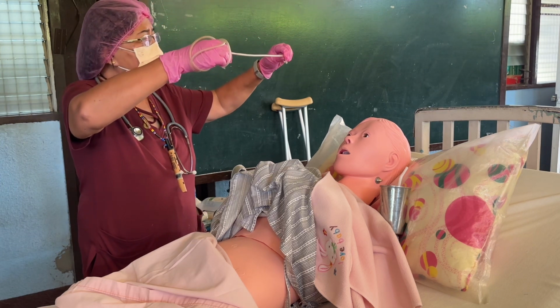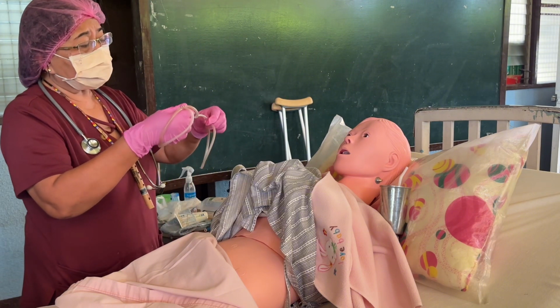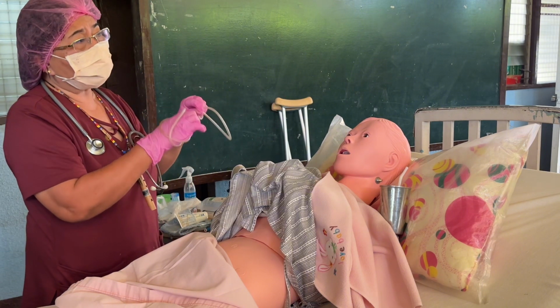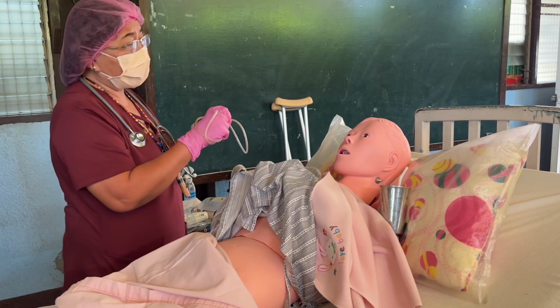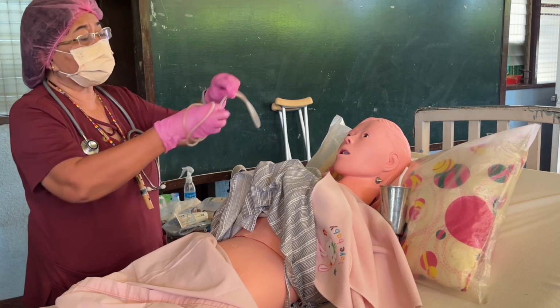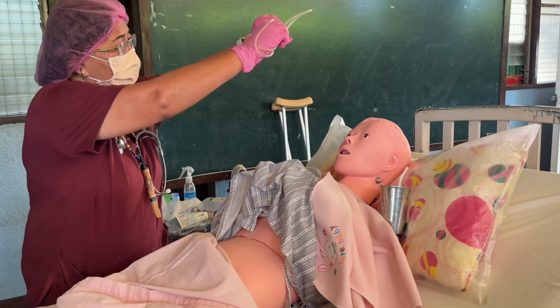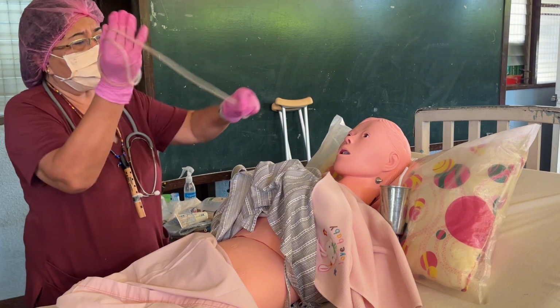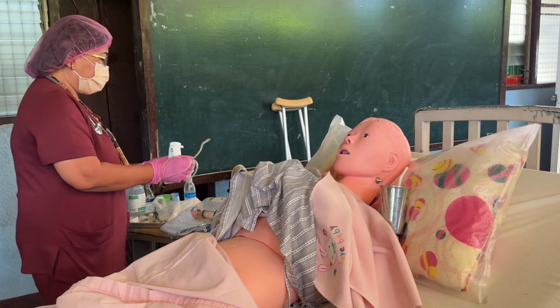There are lots of lines on the tube, class, where you will remember how long you're going to insert. If there is none, you can put a plaster as a marker, landmark, or an indicator of how long you're going to insert. So I'm going to insert here. Can you see the marker? So you have to remember that one when you do insertion. Okay, I'm now going to put your white jelly.